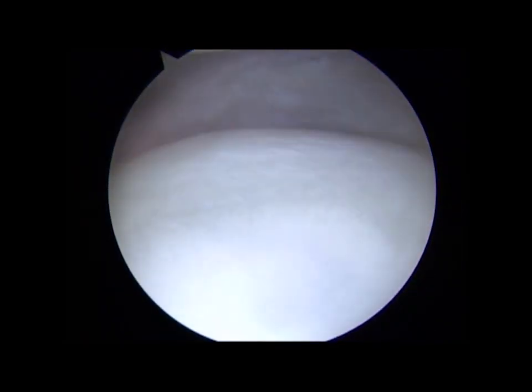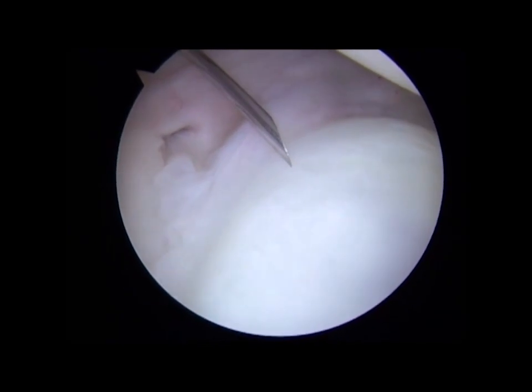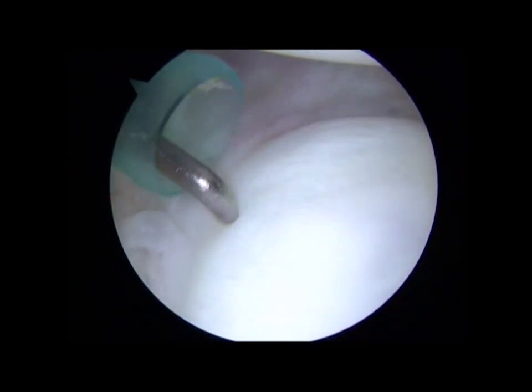There are a couple of challenges in this particular patient group surgically. One of those challenges is accurately identifying the margin of the glenoid bone. With an intact labrum and an often undersized labrum, this can be difficult.